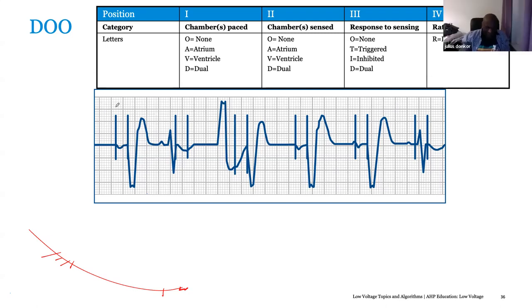Is that so? It's not a very good ECG though, Dr. Rafi. Sorry, you can only see the chest leads. You can't see any limb leads. But I'll look at it properly. Okay, we can comment on it in the lecture. Just zoom it. Yeah, but for a 12 lead ECG, you should be able to see all the leads. I agree with you. But you can only see about 3 or 4, so it's not really a good one.